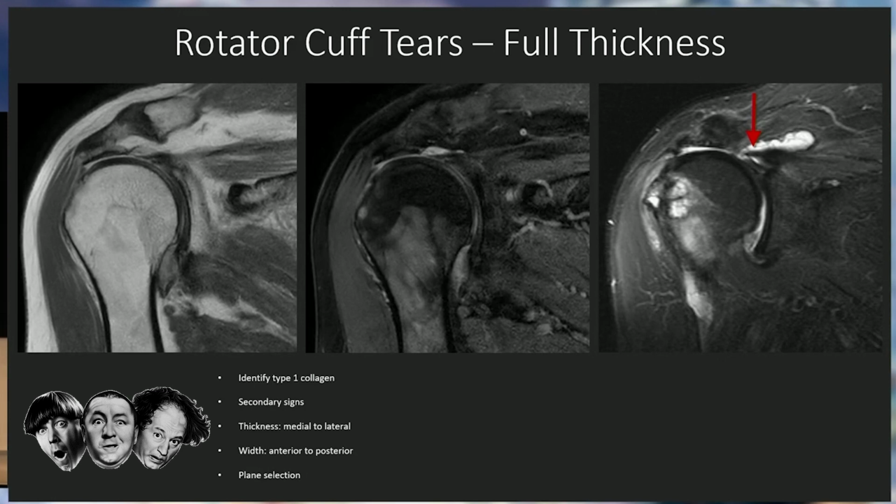But this is just another reference to the fact that, and this goes for any body part, when people start to evaluate MRI or even X-ray or CAT scan, they really get comfortable usually with one plane. ACL is a perfect example. In my lecture, I gave another example of why it can be a big pitfall to only get comfortable with imaging the ACL in the sagittal view, or only calling ACL pathology on the sagittal view, is that we can miss things.